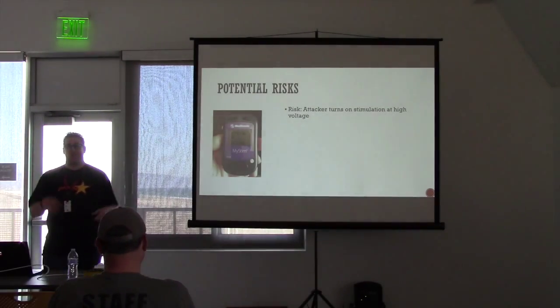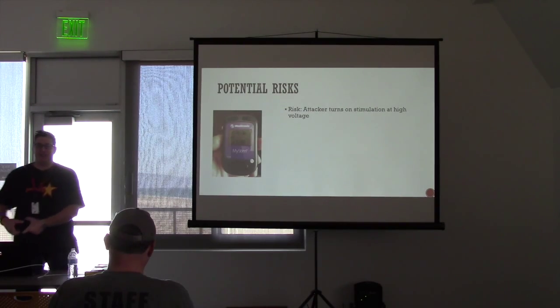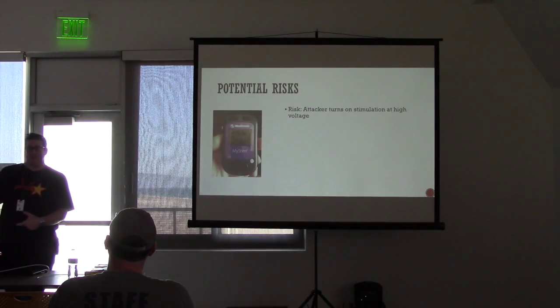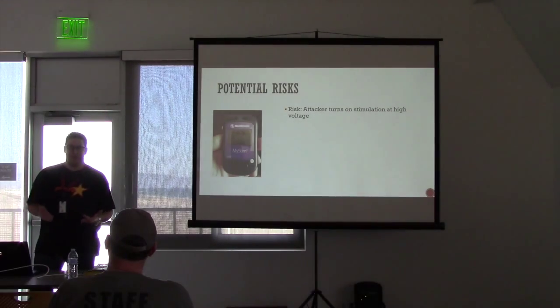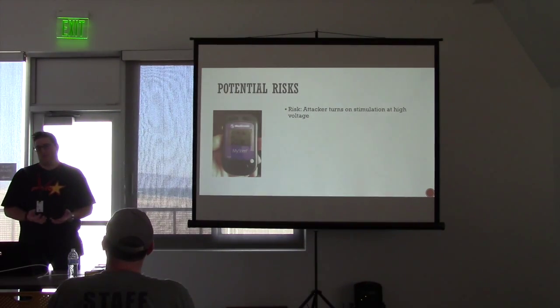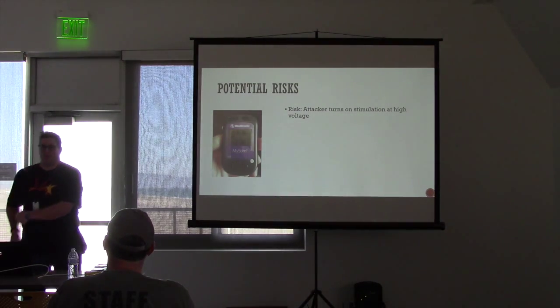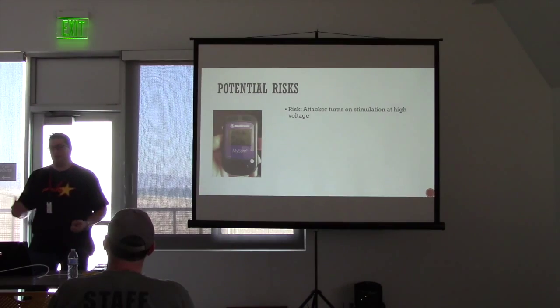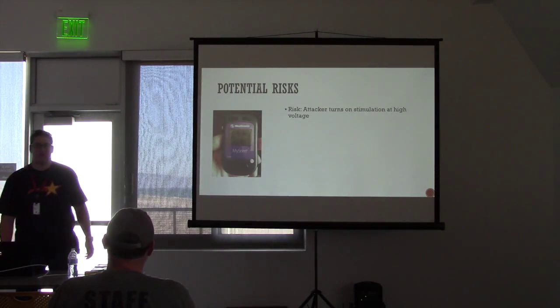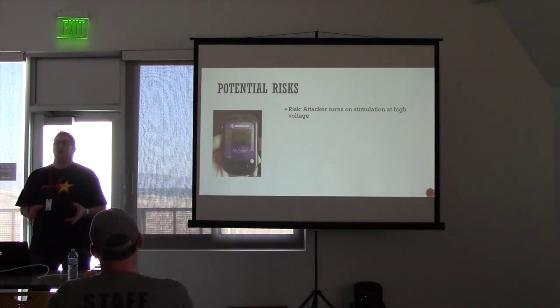And actually, when I did this threat model, the funny thing is, I was looking at having her put EMI protected tape over this device, which she just looked at me and rolled her eyes. But just like the RFID blocking wallets, I thought, worst case scenario, you can just put this tape over the device, and every time you want to program it or turn it on, you can peel it off. Didn't go over very well.